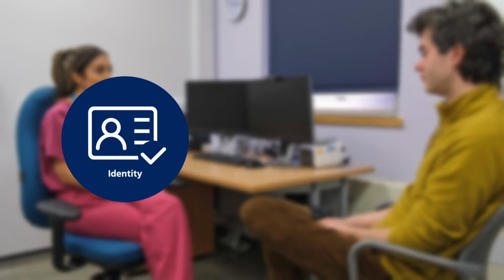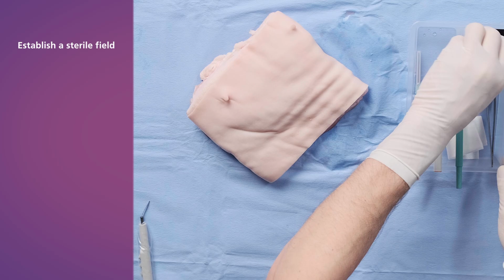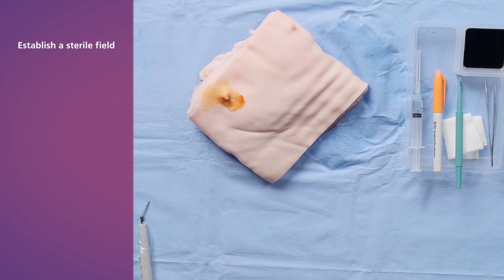Before starting the procedure, perform a pre-procedure check and ensure informed consent has been obtained. Establish a sterile field.